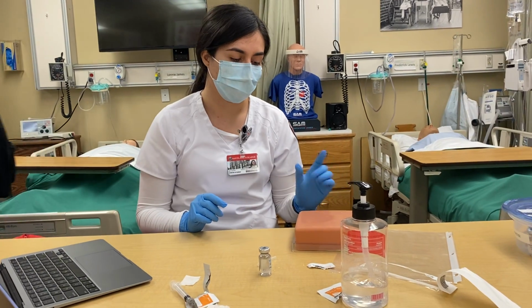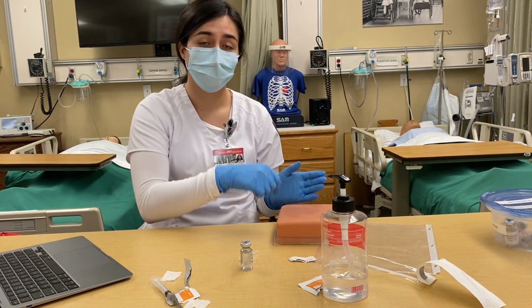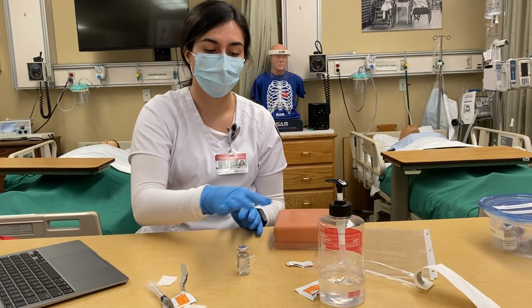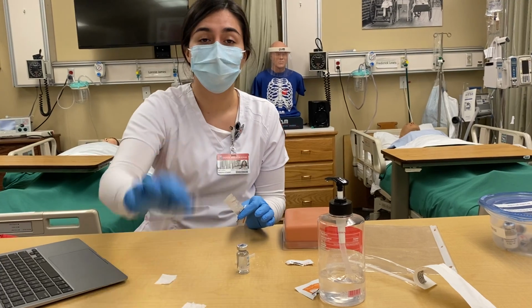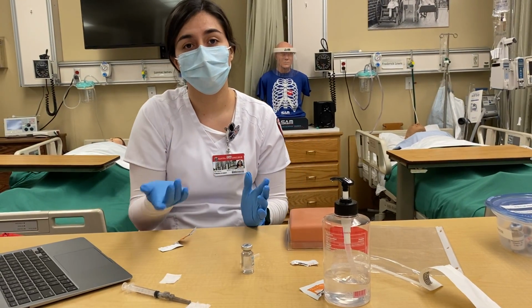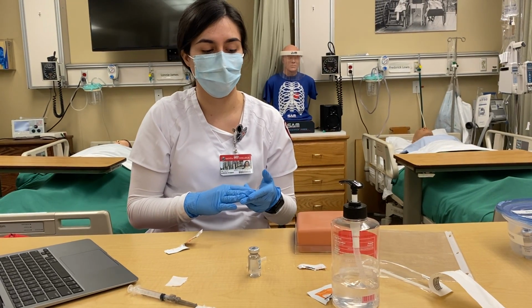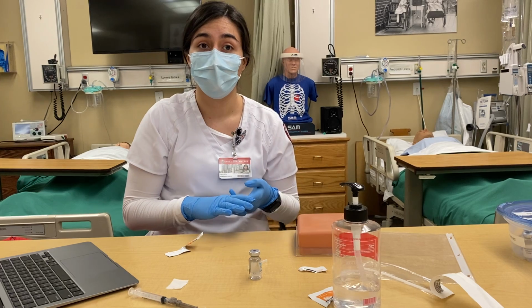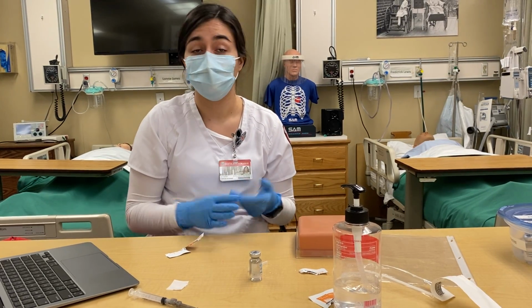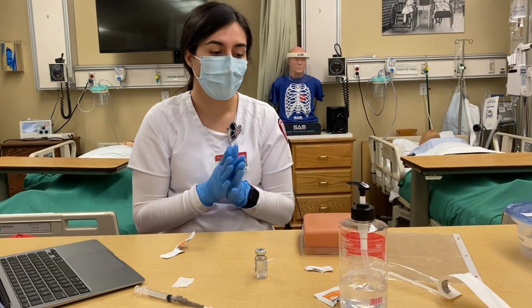And then gauze up if they're bleeding or not. Once I'm done, I get all my supplies, put this in the biohazard, and clean up, and that's it. And then document the time and the date, and the area where I performed the medication, and then my name, so they know everything was documented and it's in the system. And that's it.